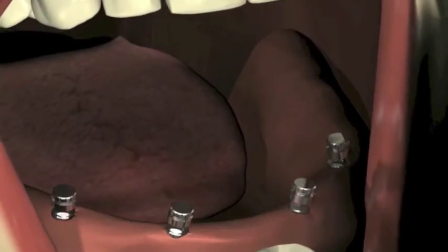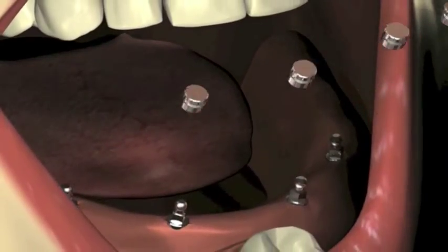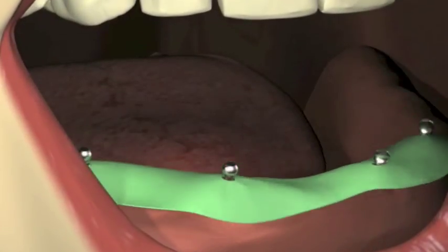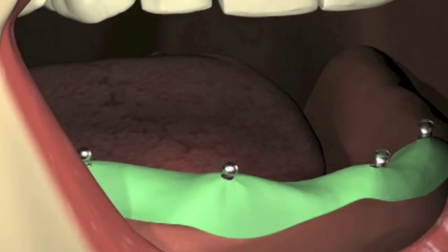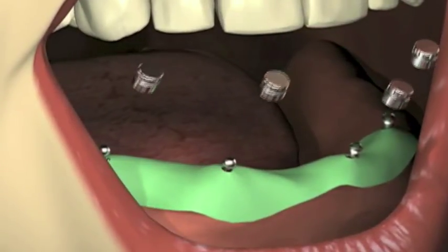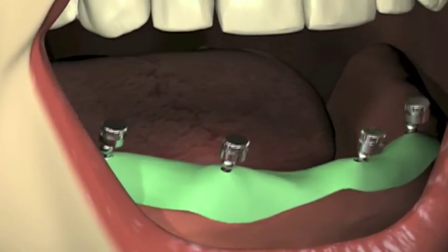To prevent any acrylic lock-on, punch holes in a rubber dam at each implant site and place the dam over each abutment, leaving only the O-ball heads exposed. Snap a retentive housing assembly over each O-ball in preparation for the final seating.